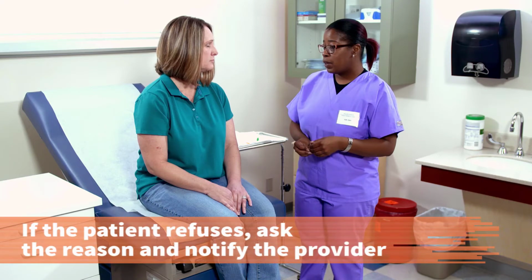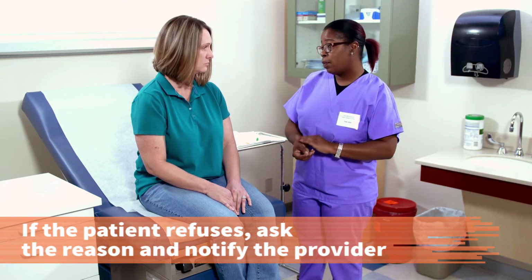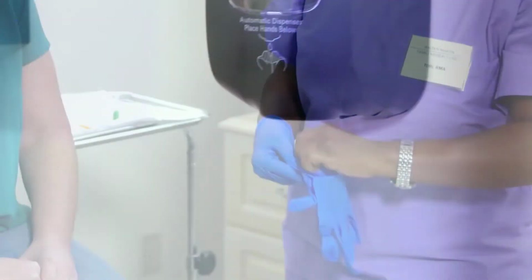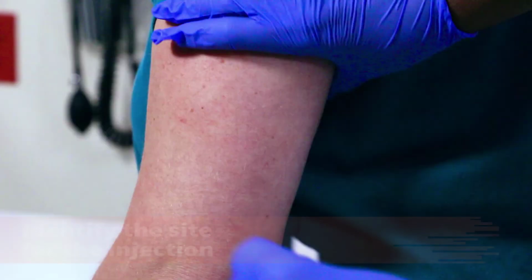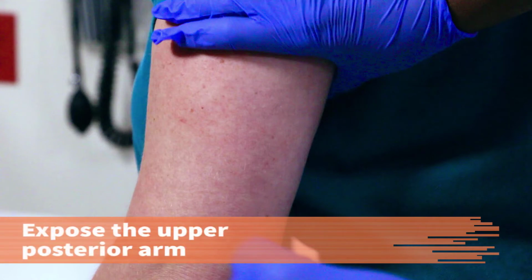If the patient refuses the medication, respectfully ask the patient the reason and notify the provider. Sanitize your hands again and put on gloves. Identify an appropriate site for an injection. Expose the upper posterior arm 3 inches below the shoulder and 3 inches above the elbow.